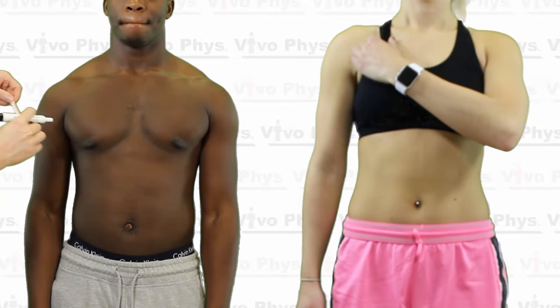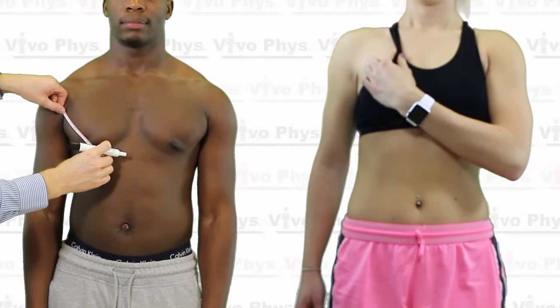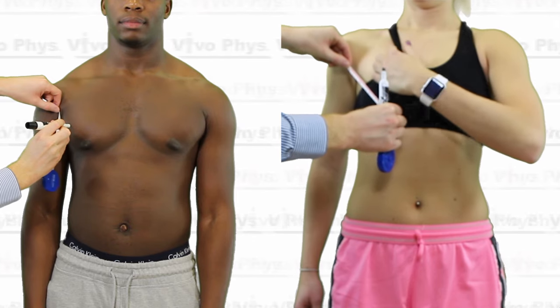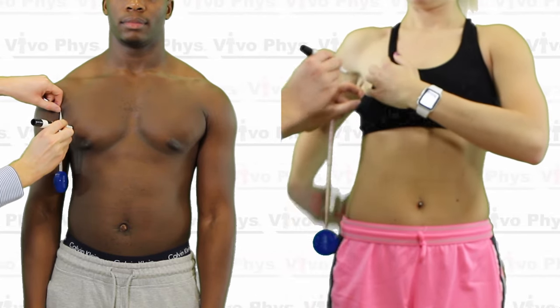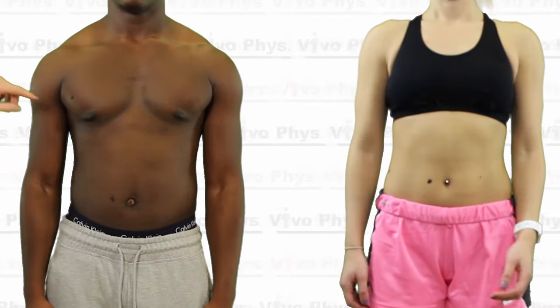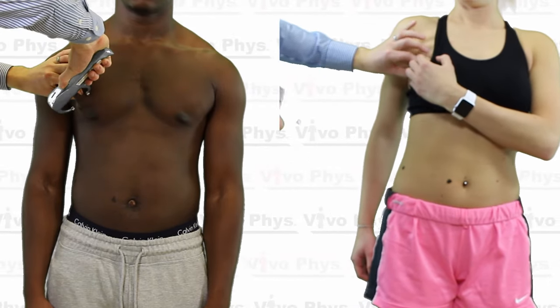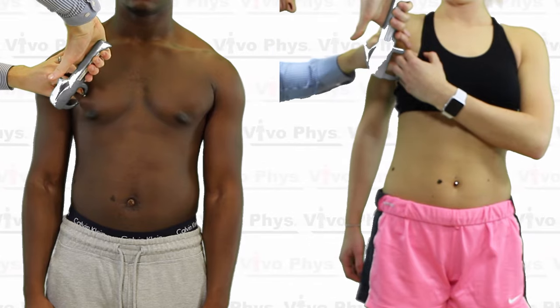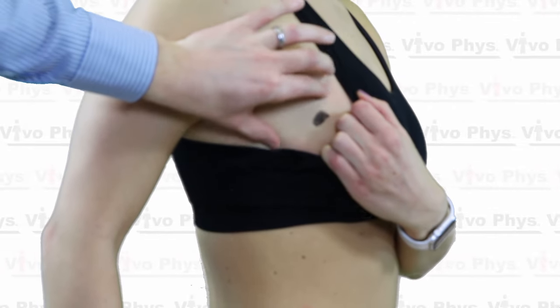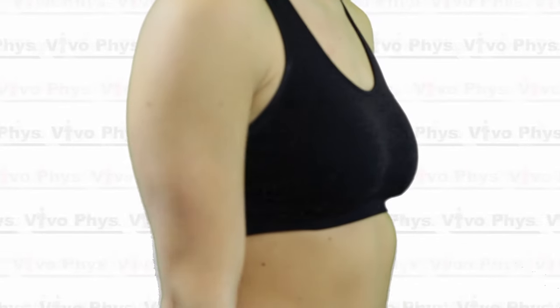The chest skin fold site is the only one that is different between males and females, and the difference is pretty small. You're going to look for the armpit and the nipple of the individual. If you can't see the nipple — for instance, if they're wearing a sports bra — you're going to estimate where that would be, basically assuming it's in the center of the right side of the chest at the bottom. For a male, you're going to go halfway between the armpit and the nipple and do a diagonal fold right there. For a female, you're going to go one-third the distance down from the armpit towards the nipple. You will have to move the sports bra over and down a little bit to expose the site.